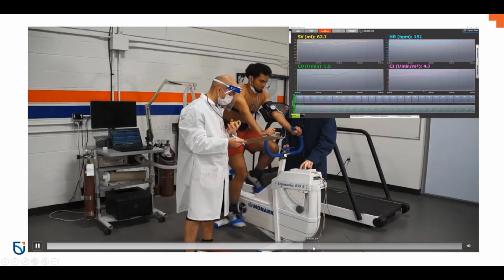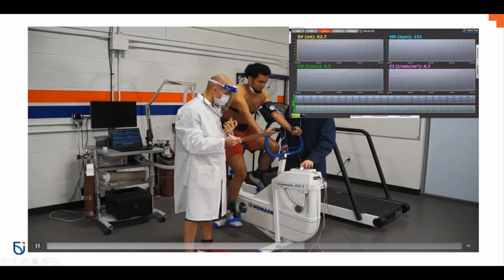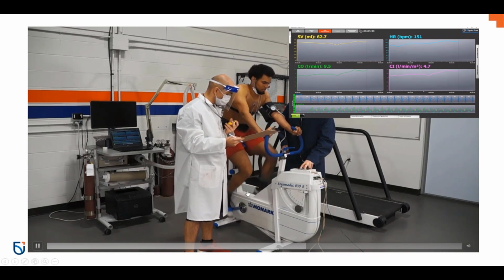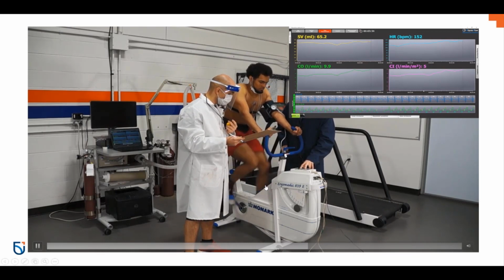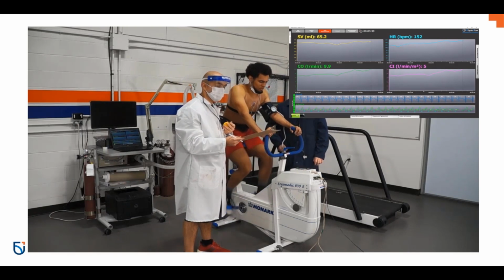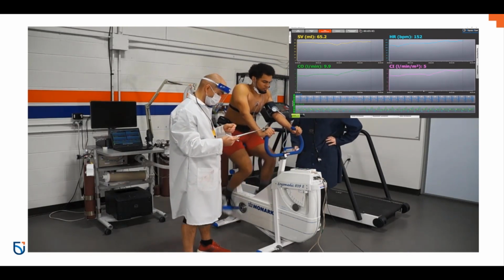Yep. And then moving on, I increase the resistance like we saw on our sheet. So we're going up to 140 watts now. You can see that the resistance is getting harder almost immediately. You can see him start working a little bit, and if you listen, you can hear a lot more resistance on the bike. It uses a flywheel with a friction belt on it, so the harder he pedals and the more resistance is on it, the more you can hear it.